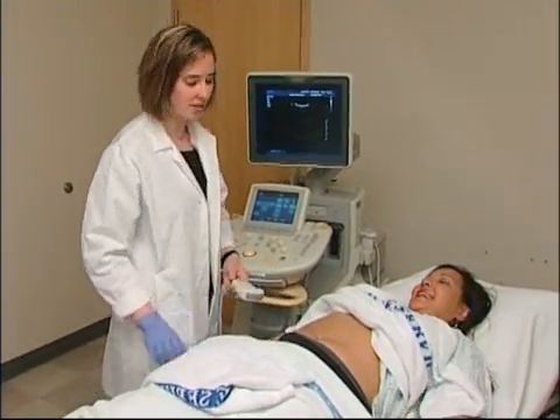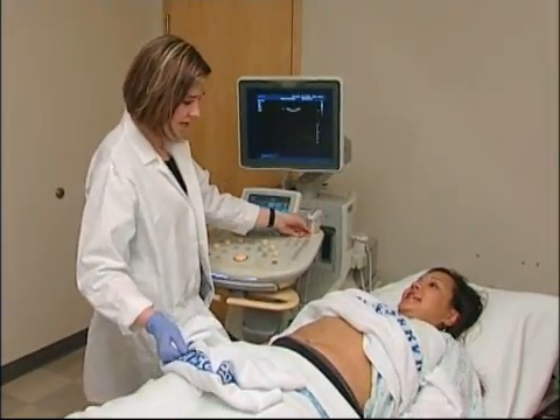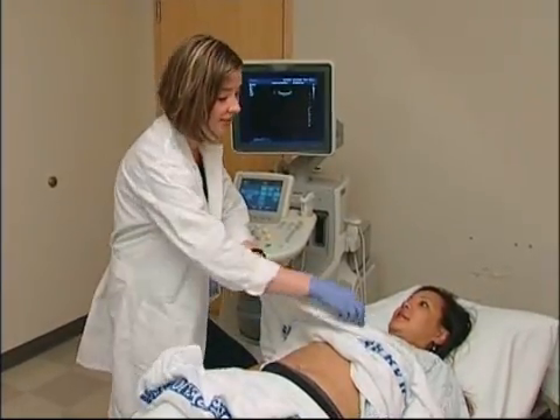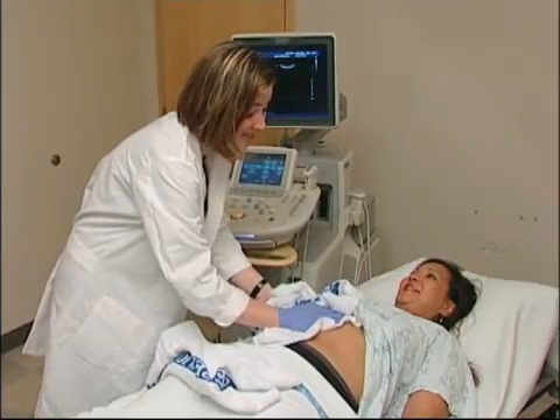It looks like we got all the pictures that we need — we're done. When the exam is over, the gel is wiped from the skin and the patient can resume regular activities. A radiologist will review and interpret the findings and send a report to your physician, who will then give you the results.